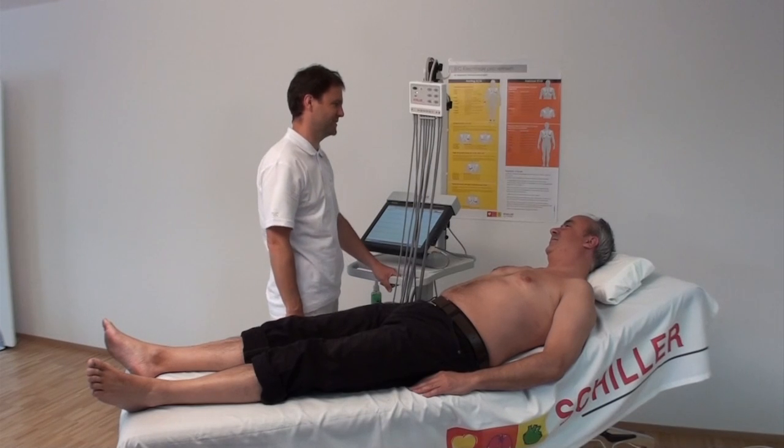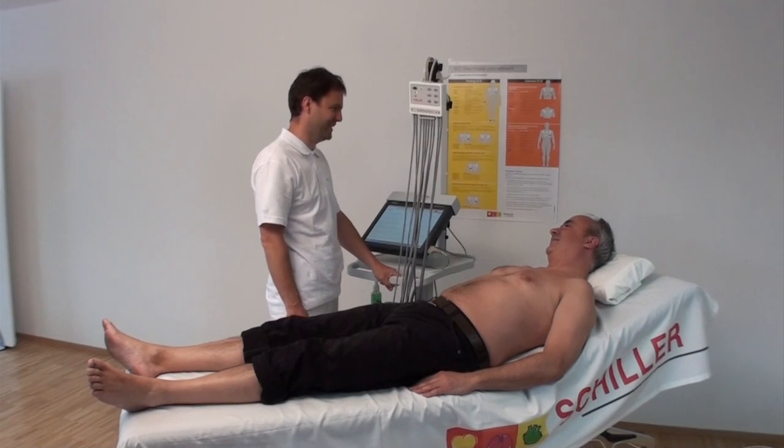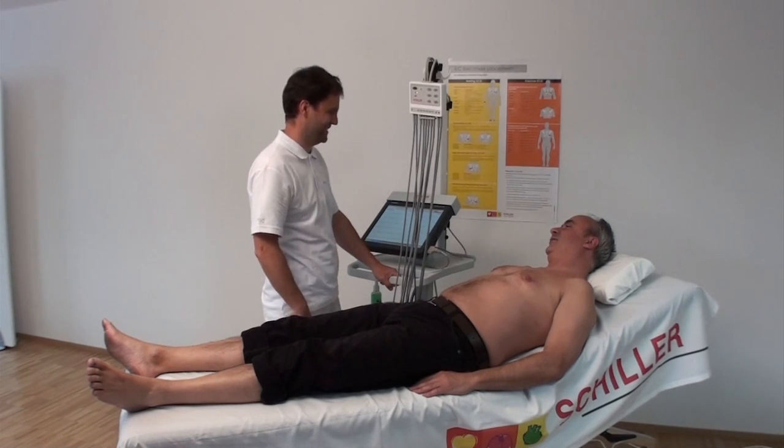In this instruction we show you how to apply the electrodes in order to achieve a good electrical signal and ensure a successful recording. The unit used is the MS 2015 with the Schiller Vacuum Electrode System.